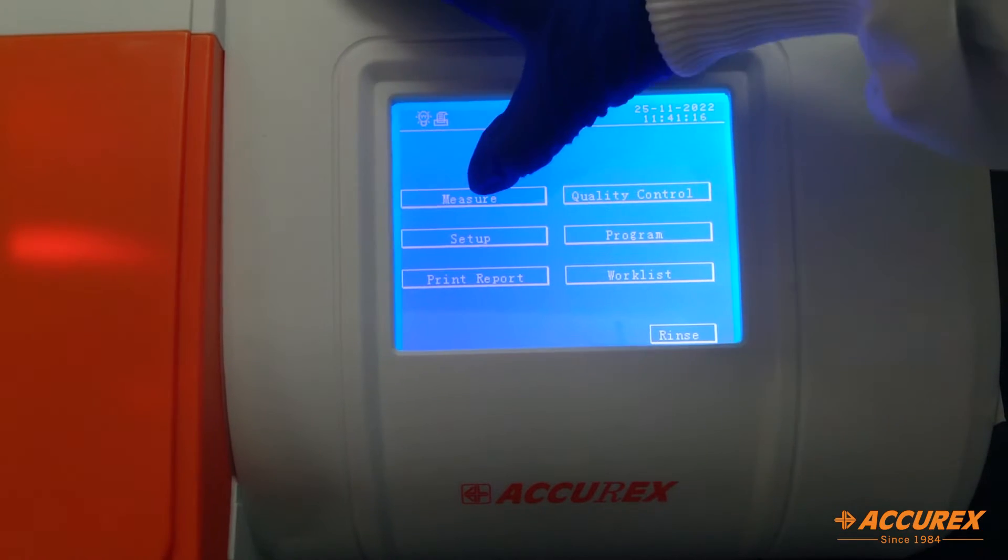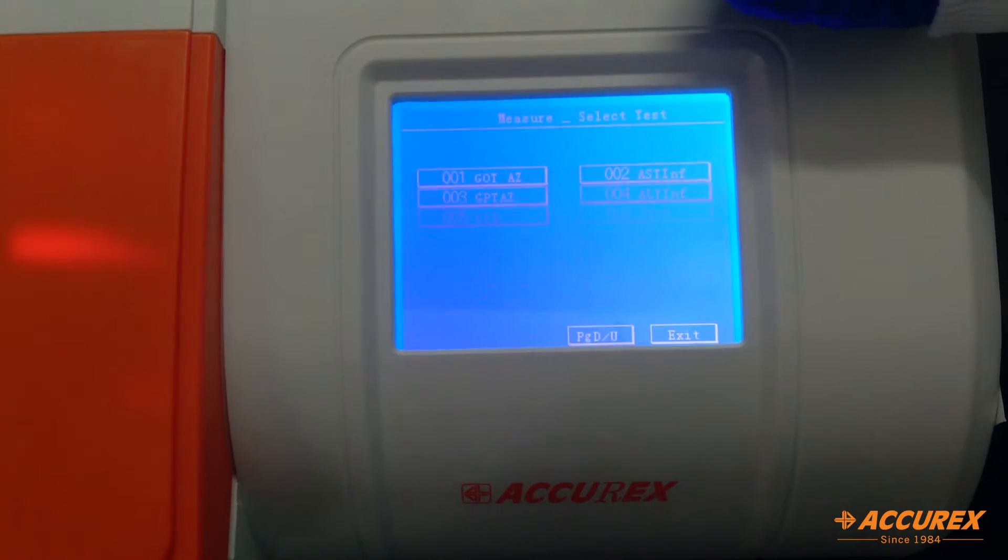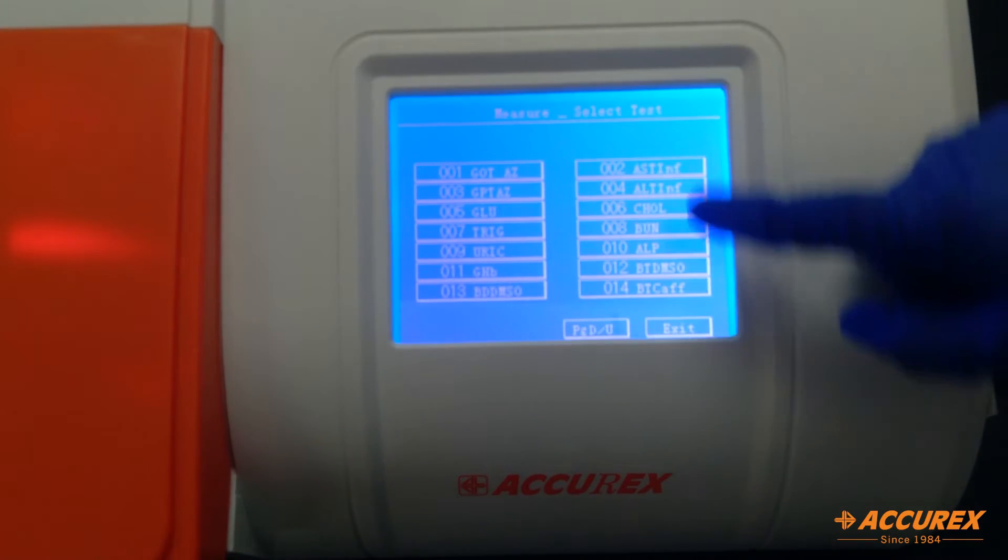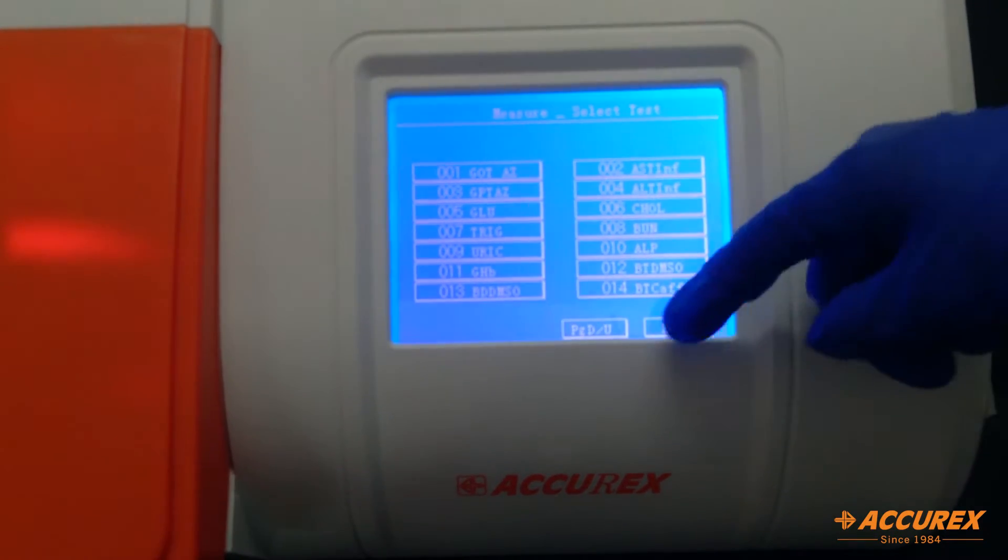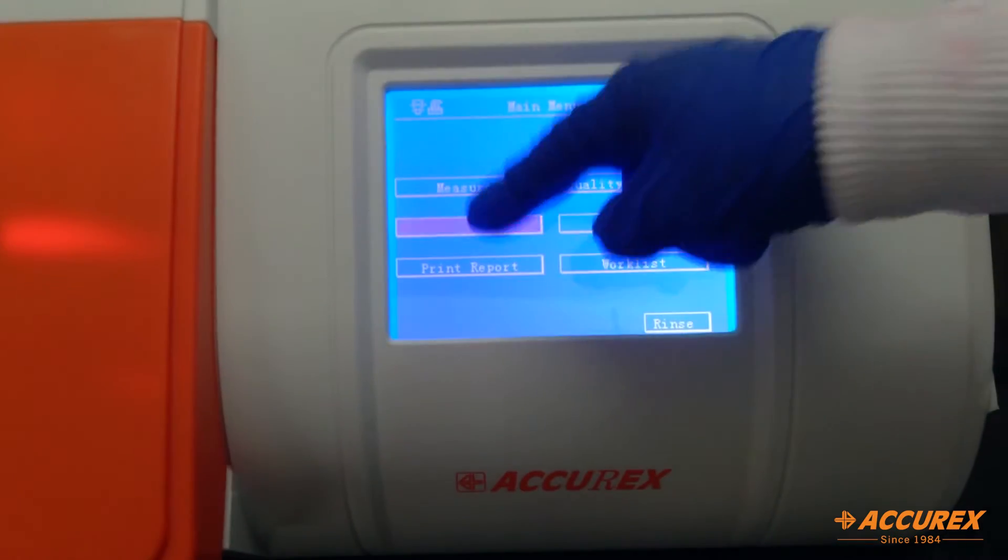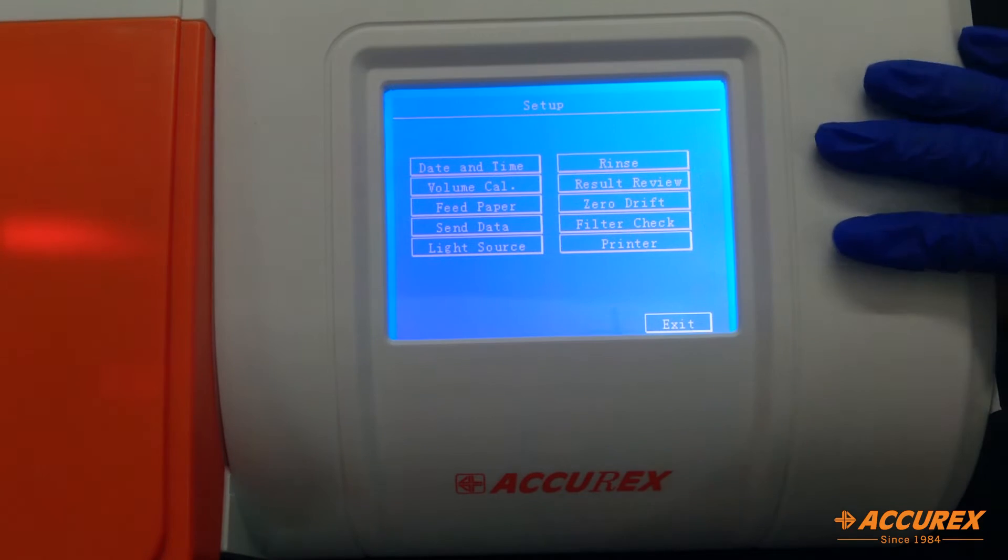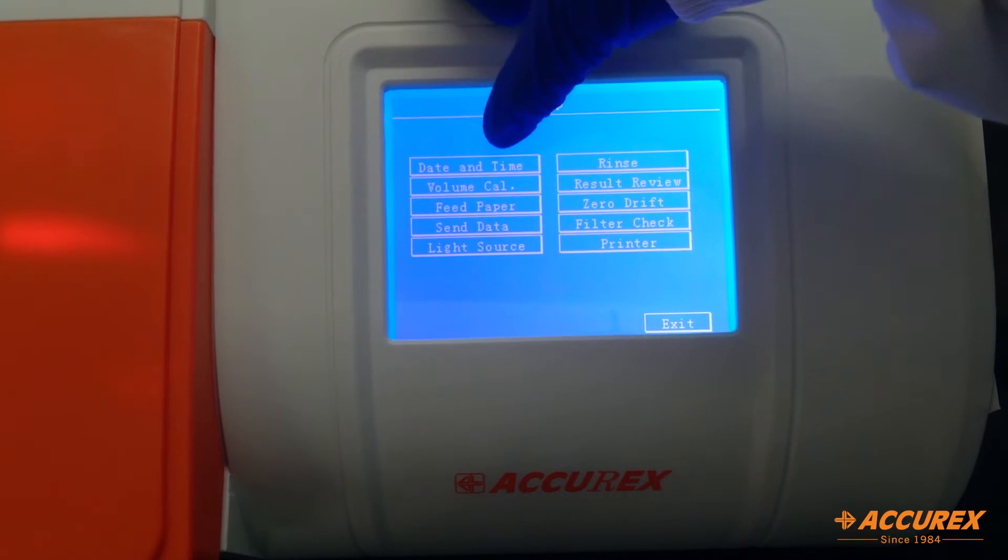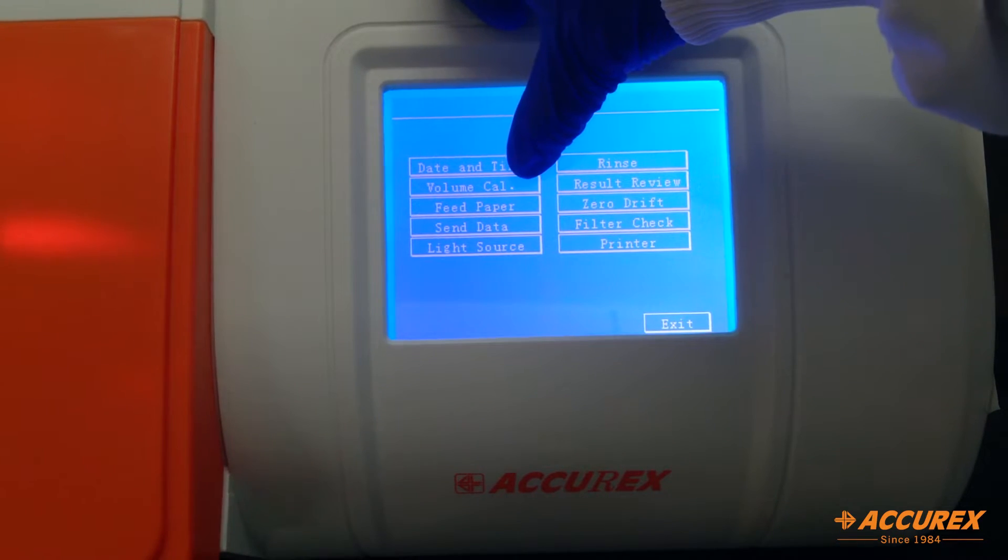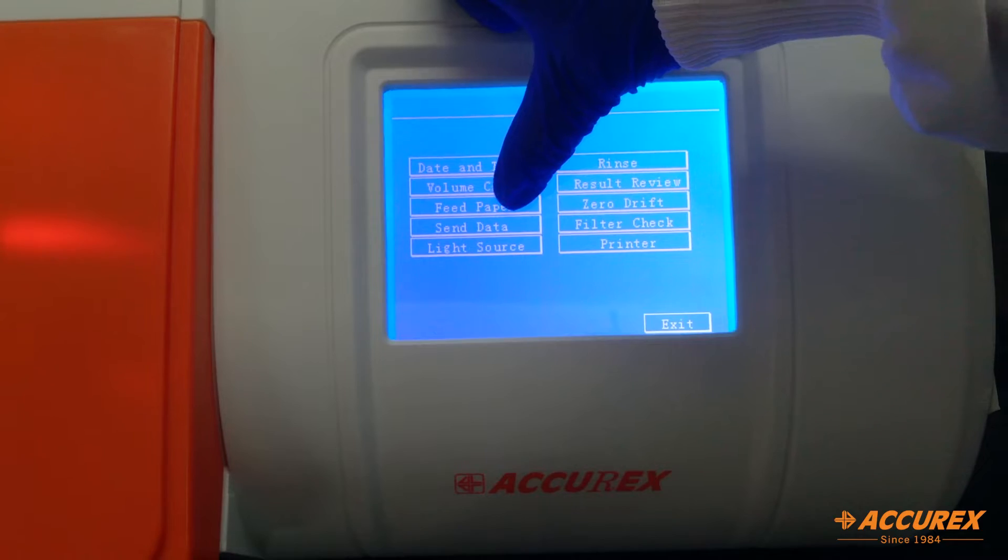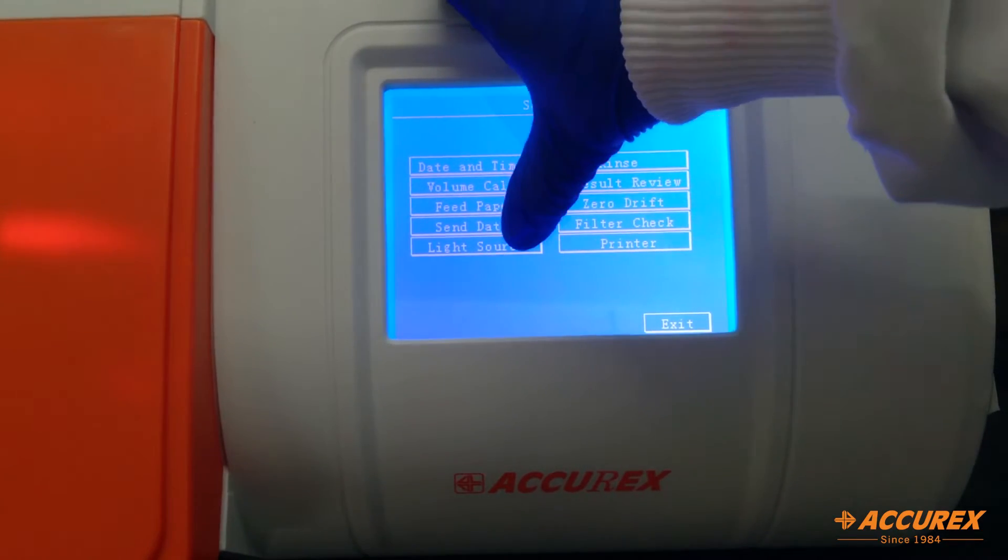So we will see first measure. Here there are all the programs given. Second is setup. Here you can set up the date and time, the volume calibration, the printer paper.